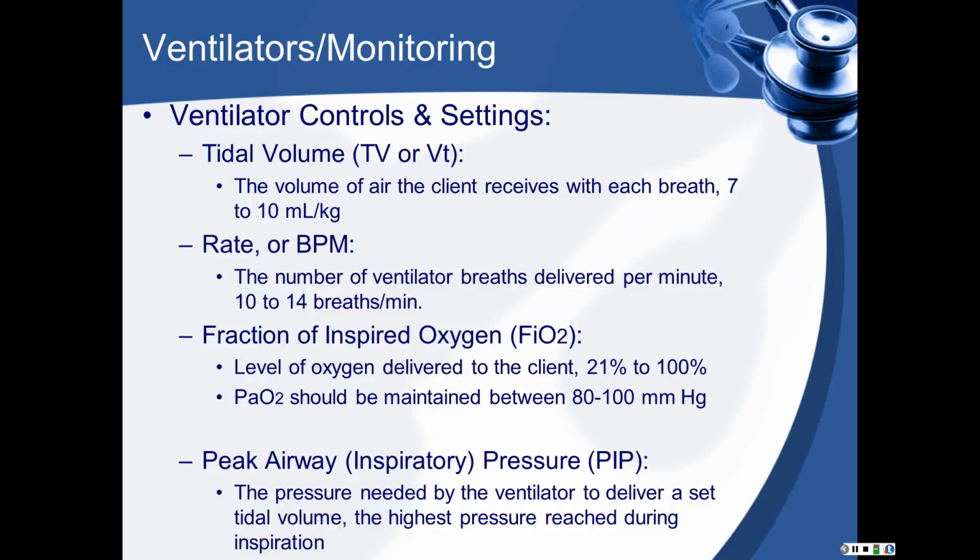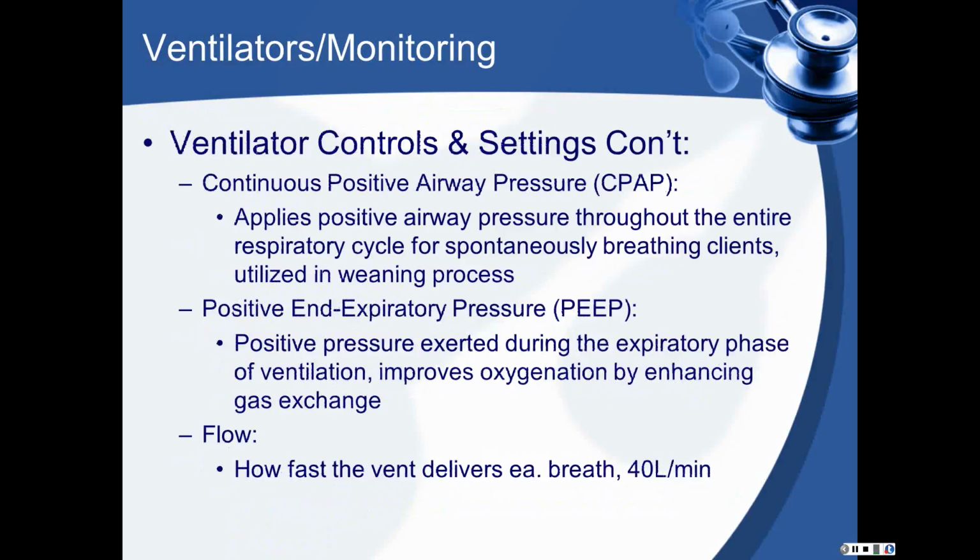Your PaO2 should be maintained between 80 and 100. Your peak airway inspiratory pressure is the pressure that is needed by the ventilator to deliver that set tidal volume, and it's going to be the highest pressure that is reached during inspiration on the client. Your O2 saturation should be maintained at greater than 90%.